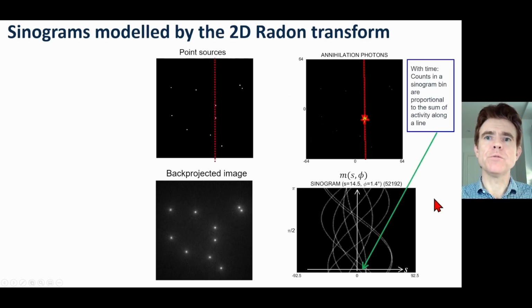Right, to go about describing the sinogram using an integral equation, we're just going to consider what happens if we wait and collect lots of events along a particular line of response. So I'm representing a particular line of response by this dashed line here, and you'll notice that, to a good approximation, this dashed line, imagine that as connecting two crystals inside a PET scanner.